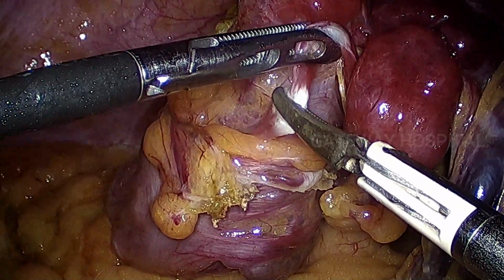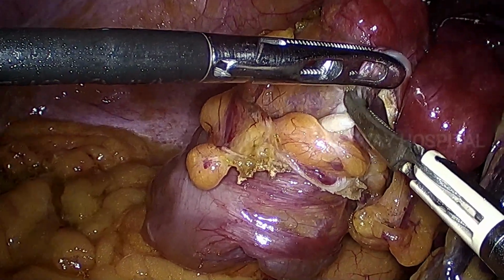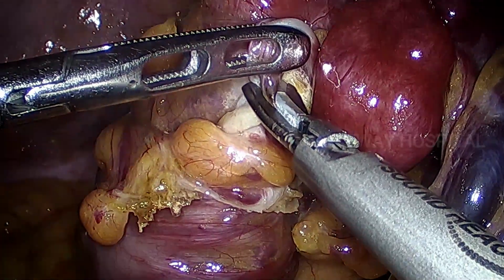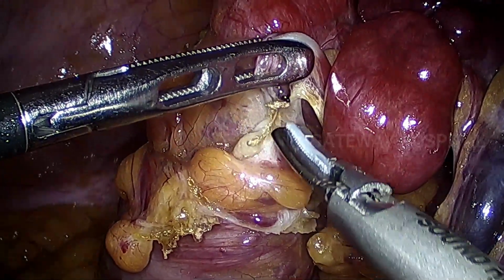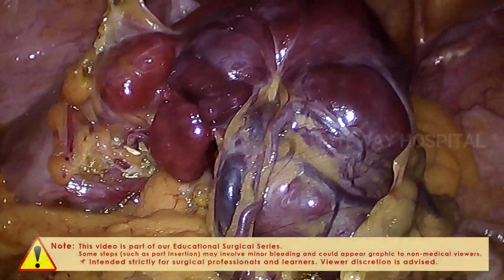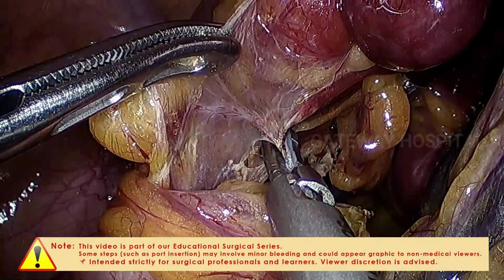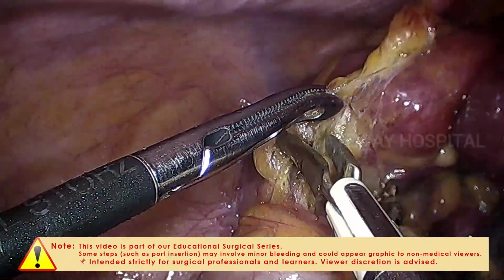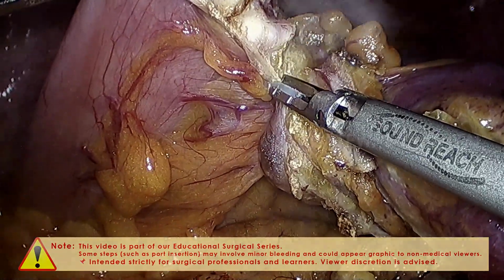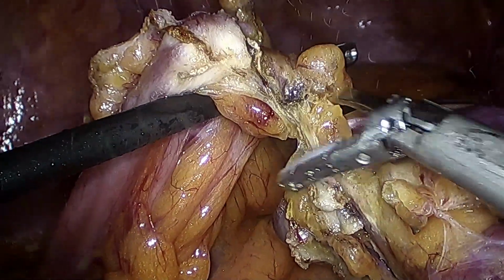So we are sealing the vessels which are arising from the descending colon and its appendices epiploicae carefully and individually, and dividing with the ultrasonic scalpel. So you can see a very nice distance between the descending colon and the tumor. So now we have almost completely detached the blood supply from the descending colon, and the tumor is completely detached.